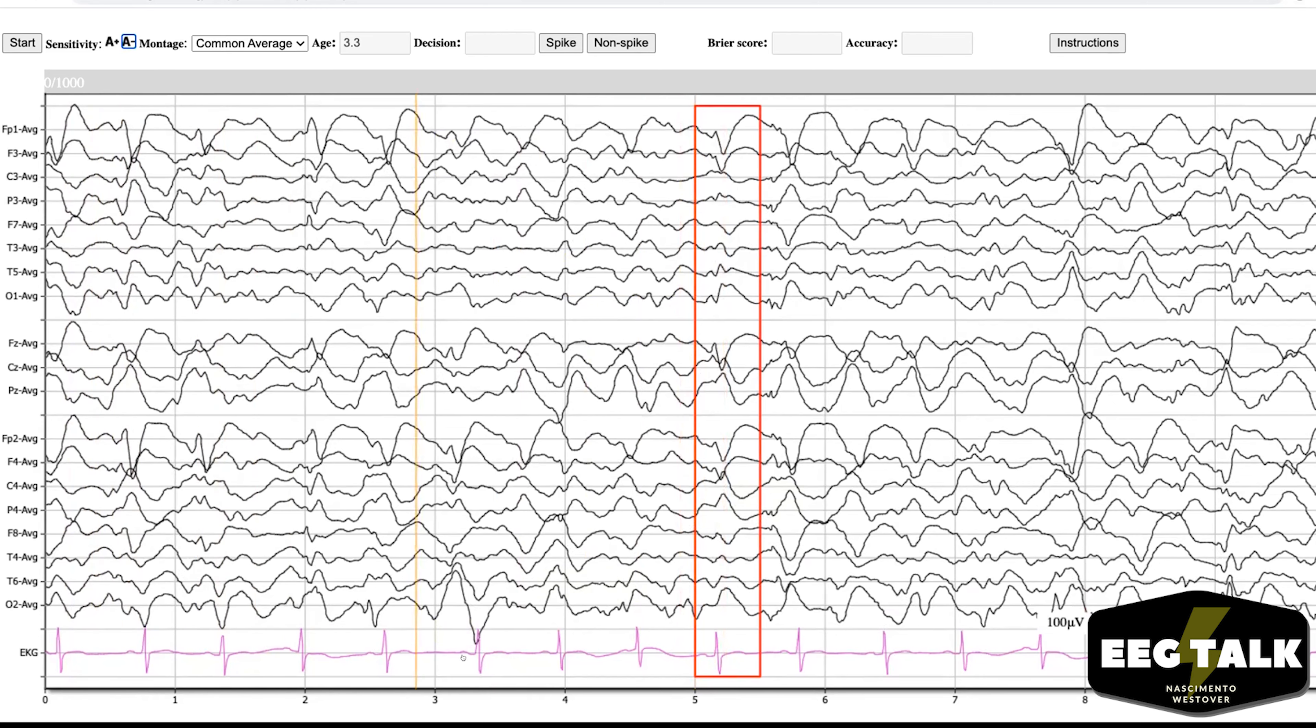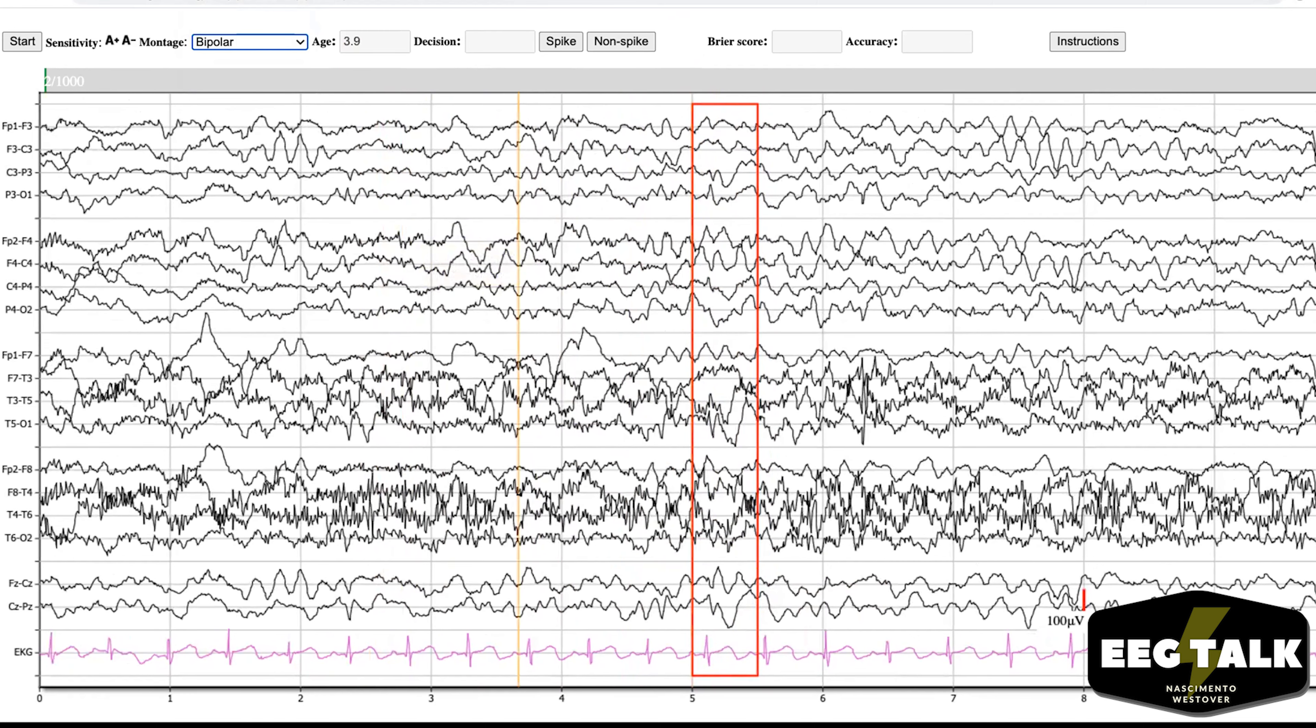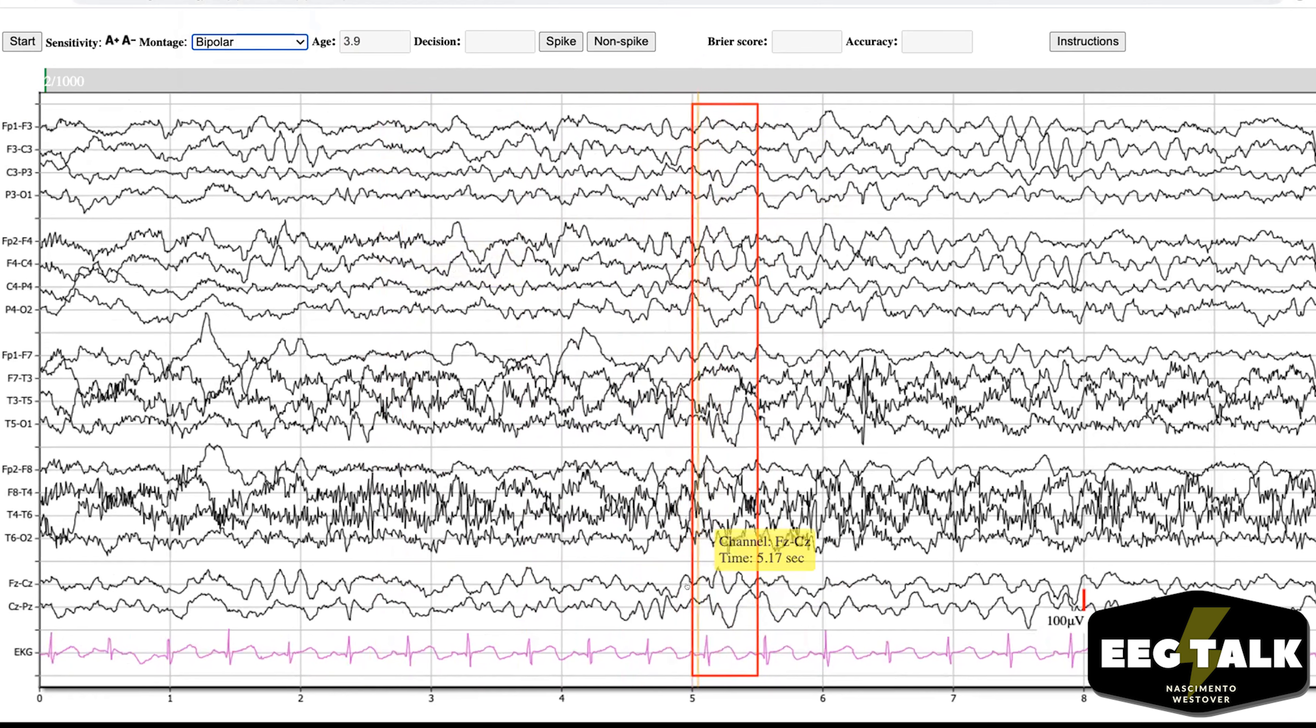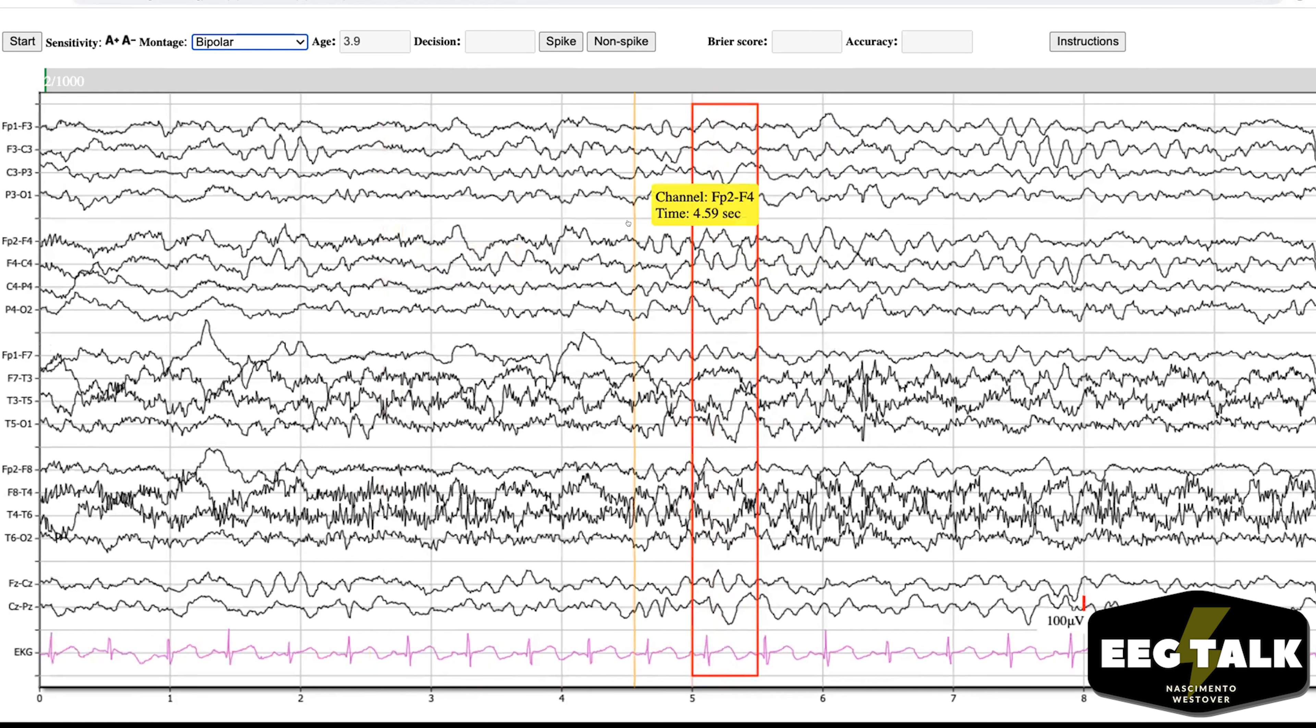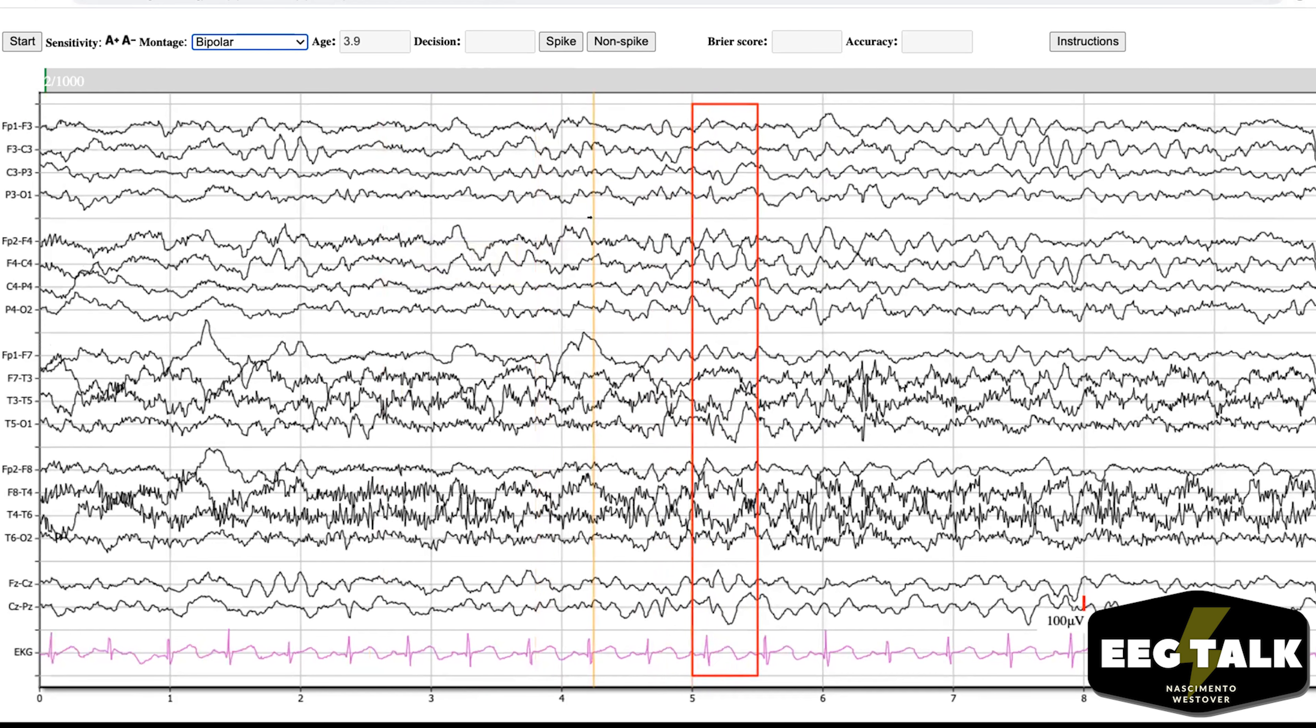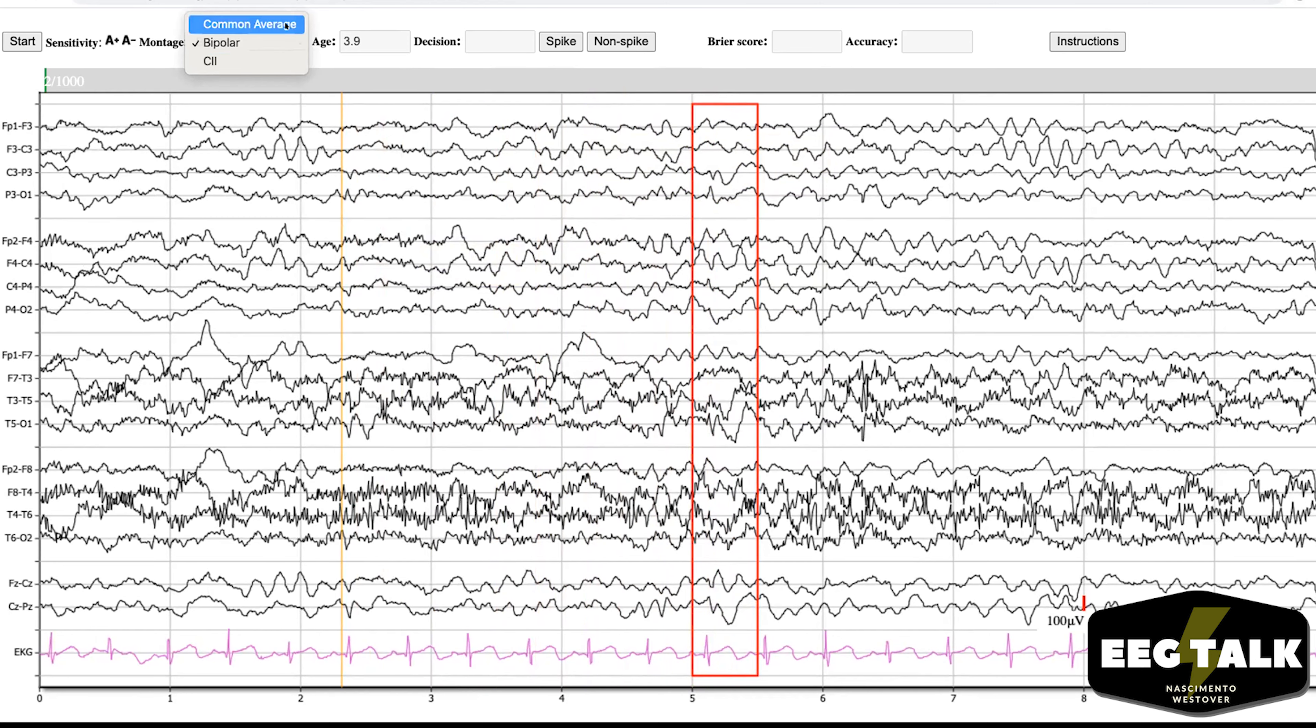And what's this pink lead here, JJ? This is the EKG, this one. Wow, this one looks pretty challenging to me. I see that little guy over at posterior left occipital region. Yeah, it's not small and it doesn't have a slow wave. I don't know, it's kind of triangular, it's not very asymmetric, it doesn't disrupt the background very much. I'm gonna say no, but I'll bet you half of people would. I bet you this is one where people disagree. Yeah, I'm on the fence.